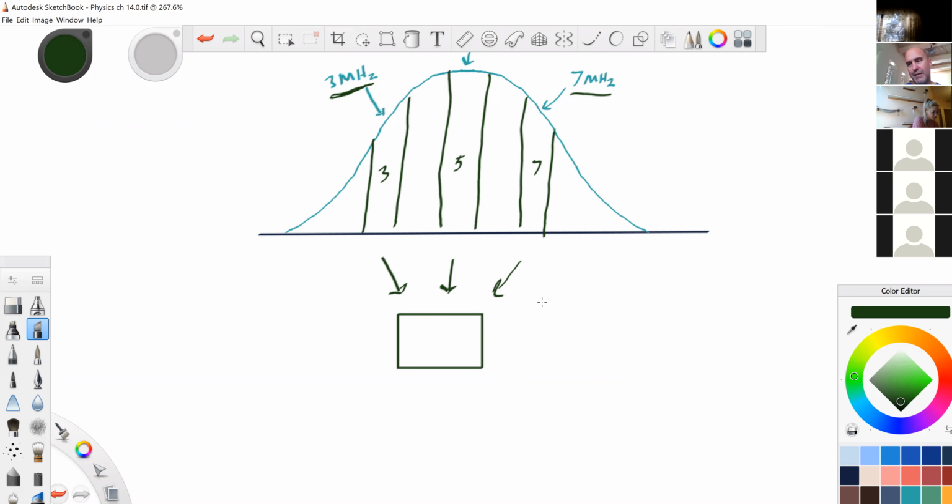So I almost forgot the actual, probably the more important part of dynamic frequency tuning. As a system, superficial in the image uses higher frequency, and lower frequency is for a deeper portion. Example.